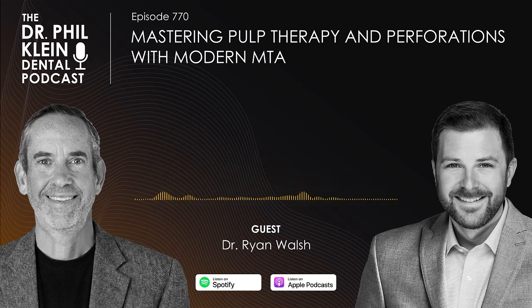So predictable long-term success. Yeah, so you said that it has a 3 minute setting time. So that's very convenient as far as putting the restorative material right on top. So you drop the MTA VPT, that's the Voco product you mentioned, and then in 3 minutes you could put a restorative material on there, direct restorative right away. And that's something that would make sense. And I agree with you.